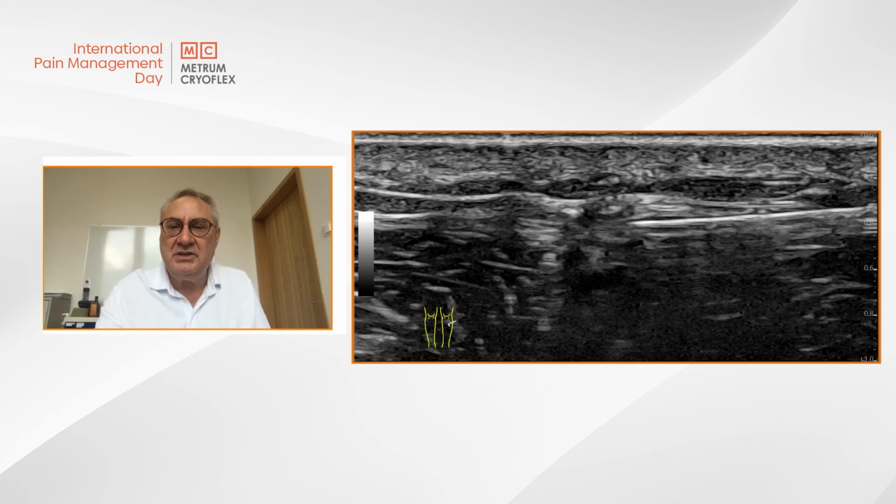Here again, you see the needle under the nerve, and afterwards the nerve, which is lifted up with the fluid all around it, in between the fascias in which the nerve was actually trapped. Okay, that's it. Thank you, Przemek, for that.